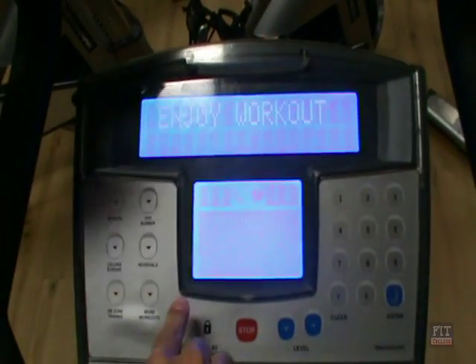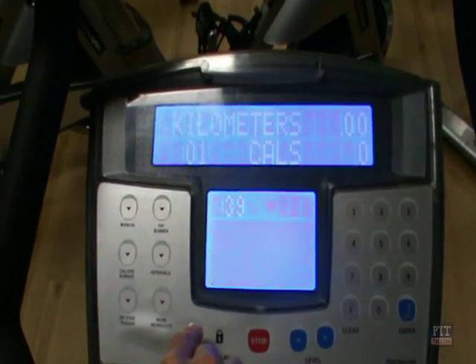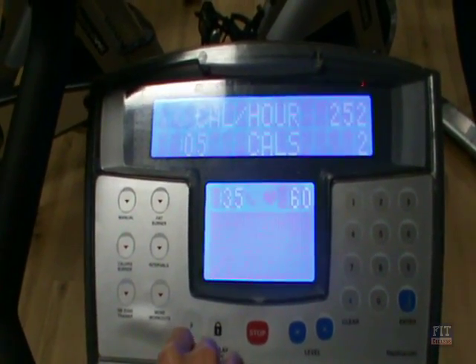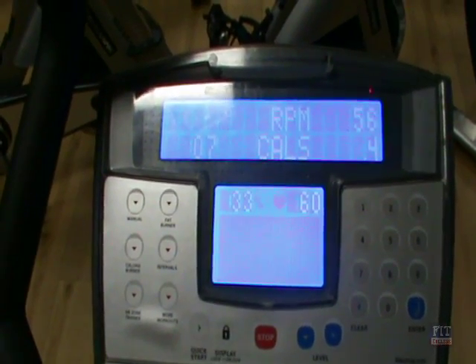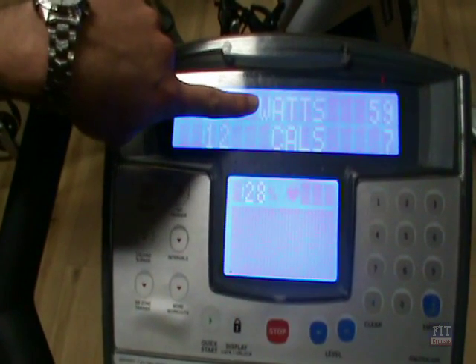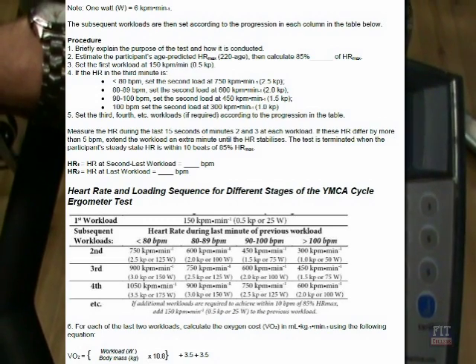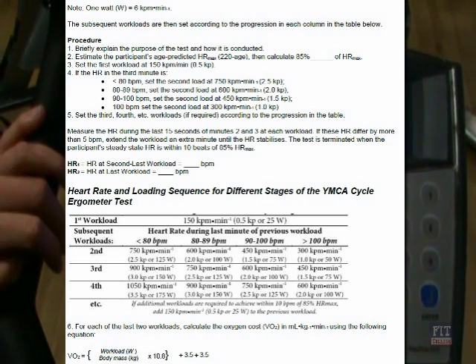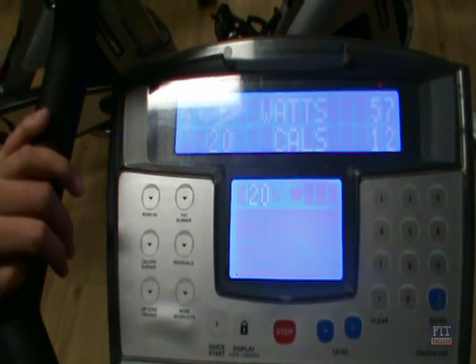Once we've done that we can then start the display. There is no set programs required — we only need the two different measurements. As you can see, we are cycling through the display setting to be able to identify our wattage, and we also need to identify our RPM. At the first level we need to utilise 25 watts.